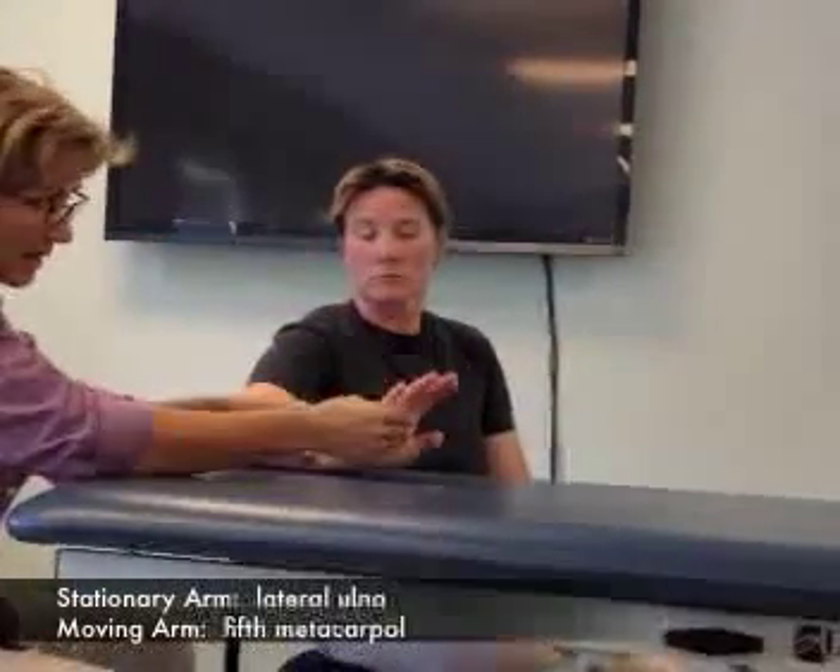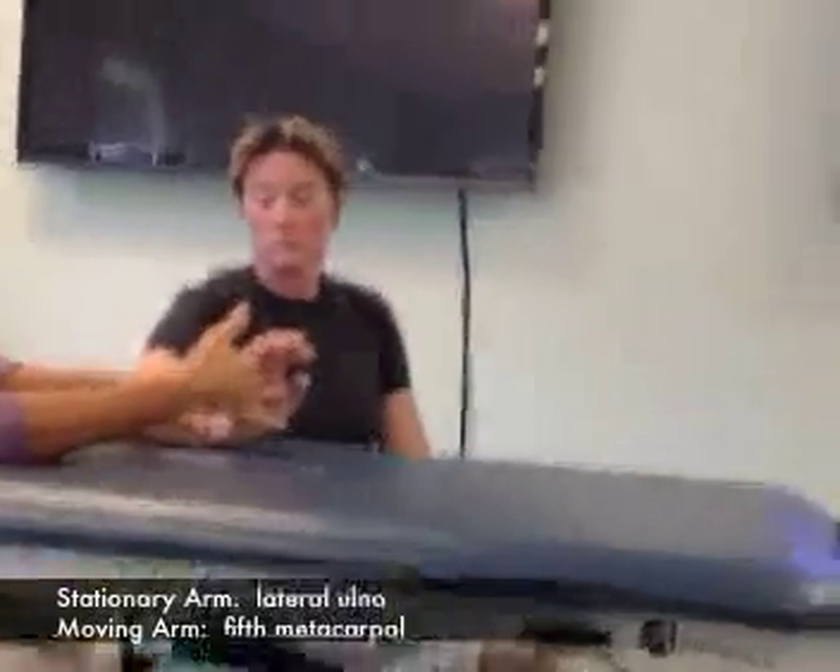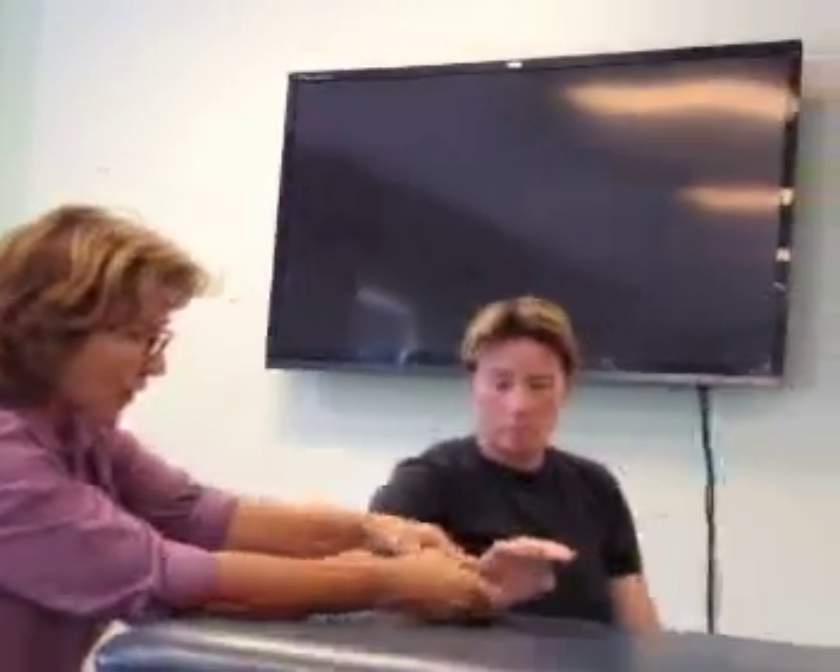So I make my visual estimate — I say that's about 70, actually, maybe. Okay, let's line you up here. Triquetrum, fifth metacarpal.